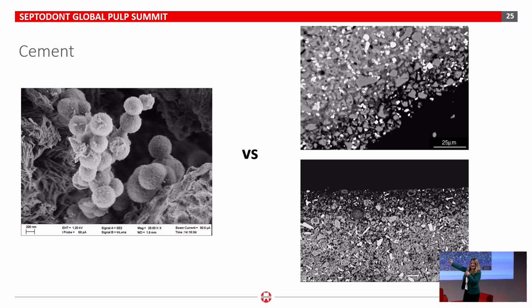So, on this side of the slide is the famous biomineralization. Hyped up a lot, in my opinion. How do you know that when you actually put the material inside somebody's body, it's going to form those crystals? Those crystals only form in the lab, where you have things at a controlled pH, controlled volumes, controlled everything.